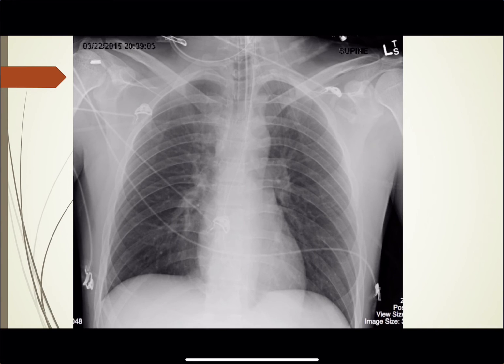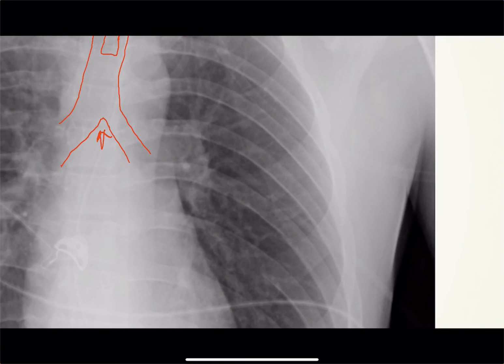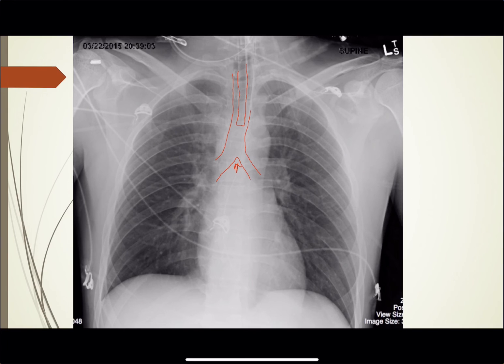Another chest x-ray — he has a little bit going on here. You can see the trachea coming down here, and on this side where it splits off into the bronchus, looks like this is going to be the carina right there. You can see the endotracheal tube coming down and terminating right there — so you can see this is in good position. You can see it's probably a good five to seven centimeters above the carina.